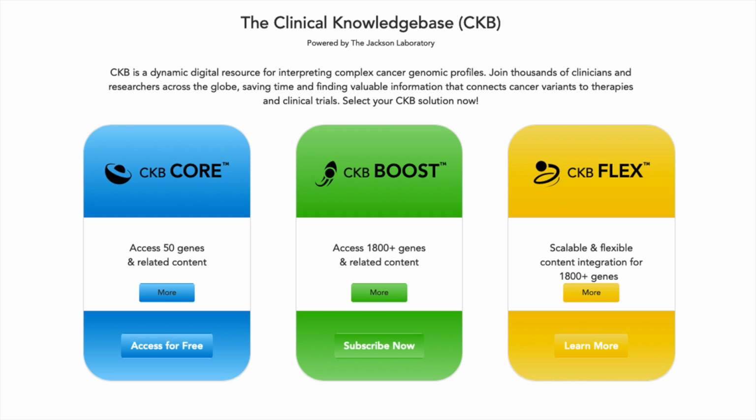CKB Core, listed on the left here, is our free version that can be accessed online at ckb.jax.org. Within Core, users have access to 50 cancer-related genes and their associated content.